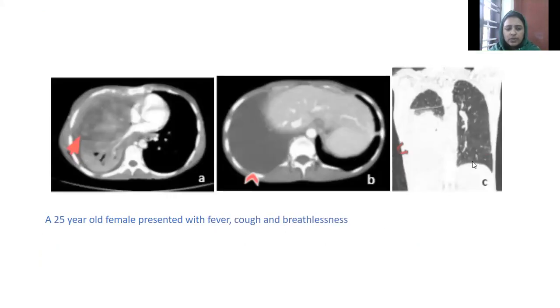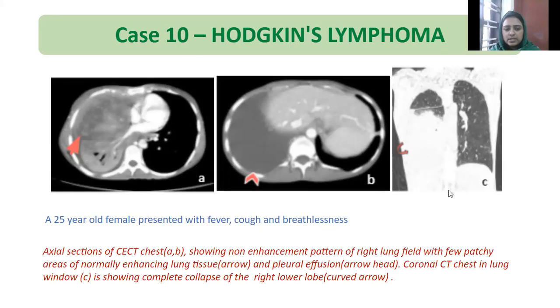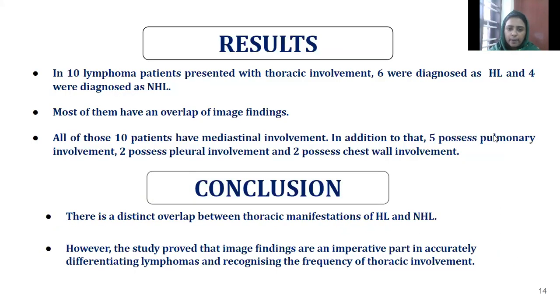Last case: a 25-year-old female who presented with fever, cough, and breathlessness. Axial sections of CT chest showing non-enhancing pattern of the right lung field with few patchy areas of normally enhancing lung tissue and pleural effusion. Coronal CT chest in lung window showing complete collapse of the right lower lobe. Biopsy revealed Hodgkin's lymphoma.